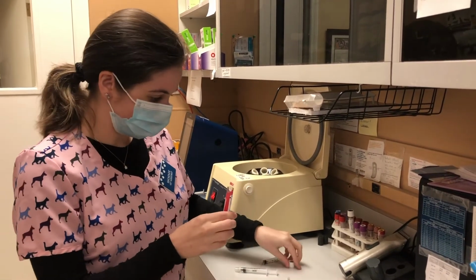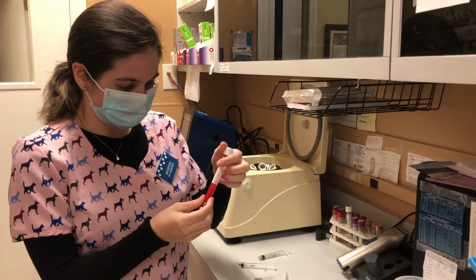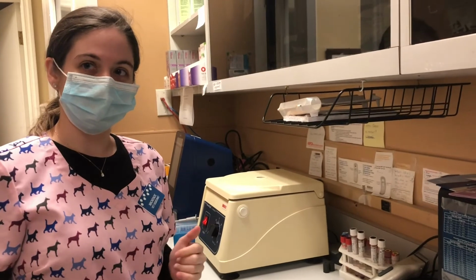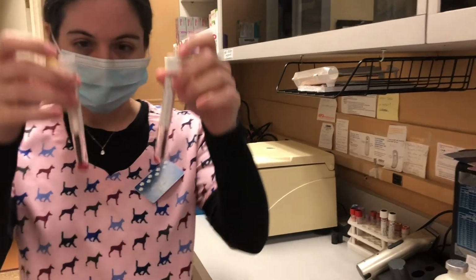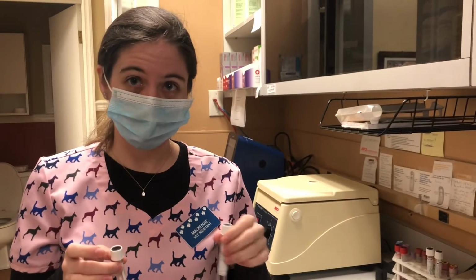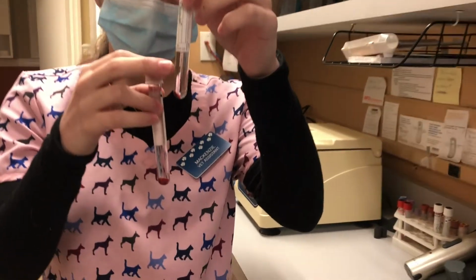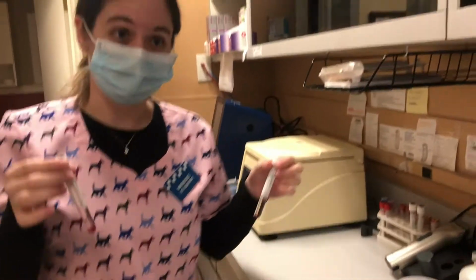You want to make sure that it's gently mixed, and I'll do that for the other one as well. Now that our packed cell saline mixtures have finished in the centrifuge, you can see that I've actually done this 2 extra times. You want to do your erythrocyte washing at least 3 times. You can see that they're thoroughly washed by the lack of color in the supernatant. It's clear and colorless, so we know they're thoroughly washed.